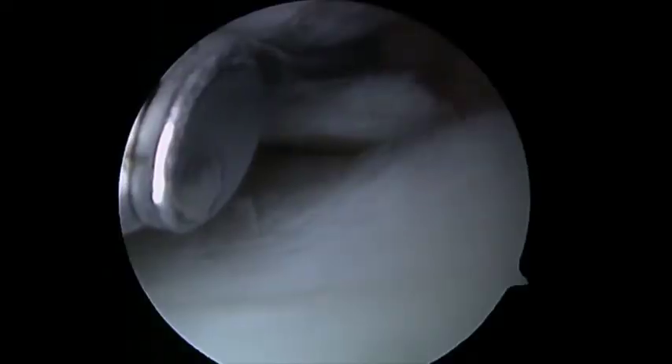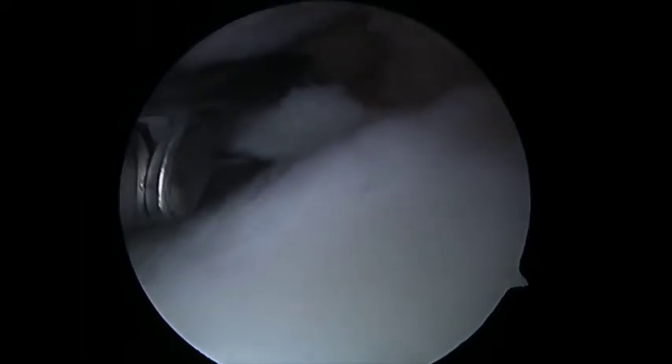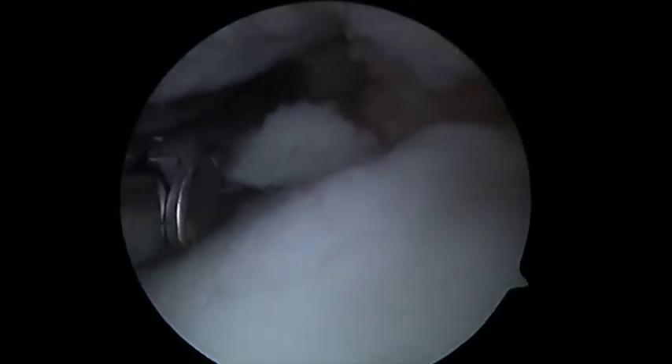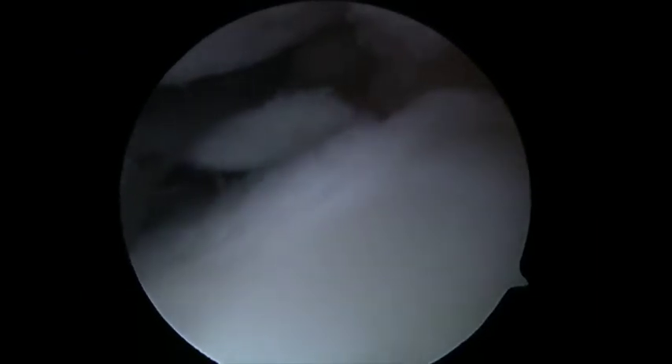In this technique, the meniscus is repaired using a Soterix NovoStitch suture passing device. The upper jaw is advanced over the superior aspect of the meniscus to the level of the meniscal capsular junction. The inferior jaw is placed under the inferior leaflet and a single deployment of the device allows for a suture to be passed around the horizontal cleavage meniscus tear.